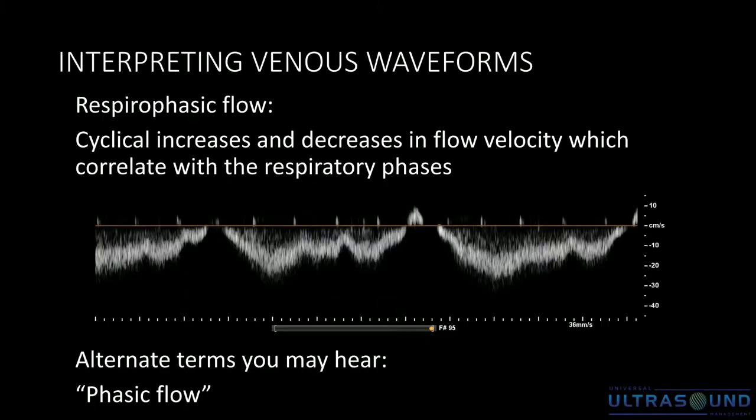So let's tie in the clinical piece using ultrasound. How can we identify these pathologies we discussed in the iliocaval system? Well, ultimately, we'd like to see them, right, with B mode. But I hear all the time, I can't see the outflow veins. The patient's ate already, they're not fasting. Or the patient is obese. Or this patient has been talking all day and swallowing a lot of air, and I can't see anything.